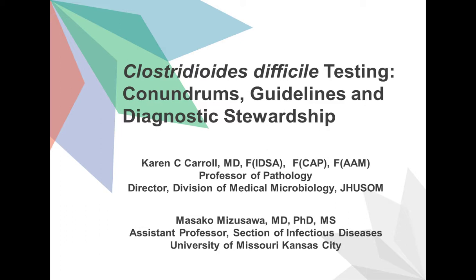So I think this is a decision that the lab cannot make by itself. I think there needs to be some discussion with GI, infectious disease, stewardship, infection control, anyone who's willing to sort of help you with those algorithms.